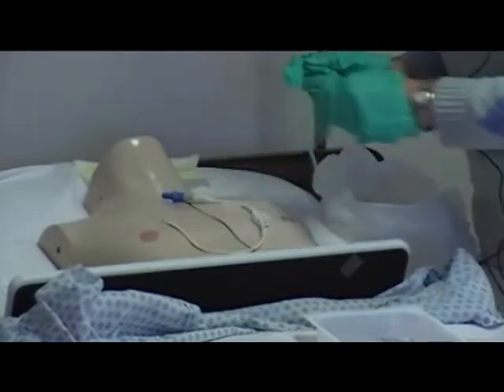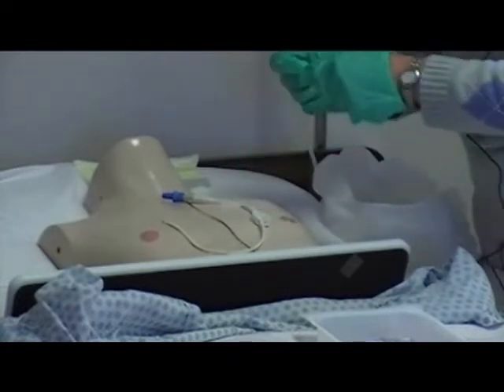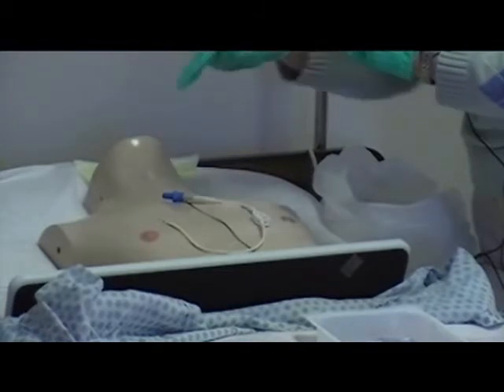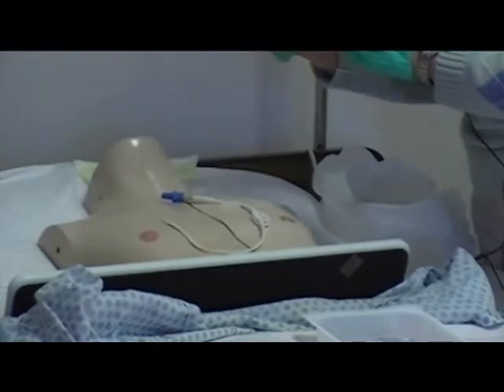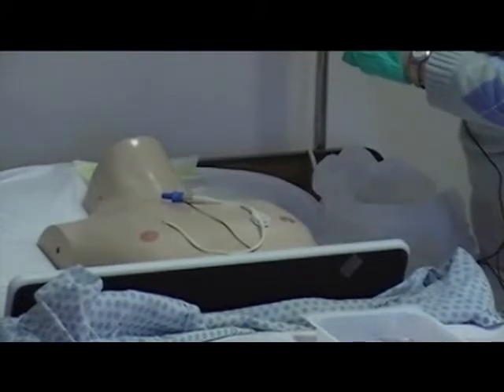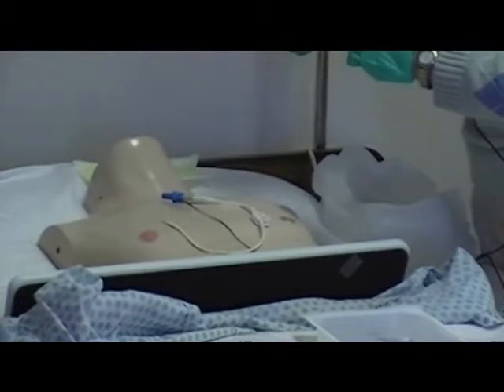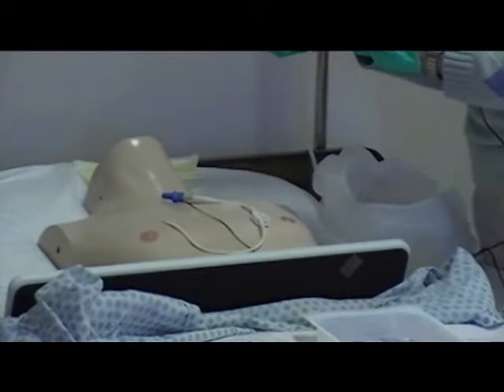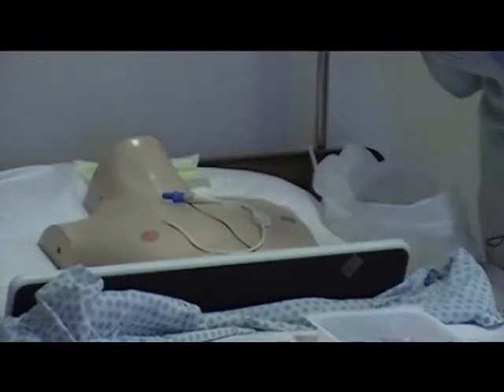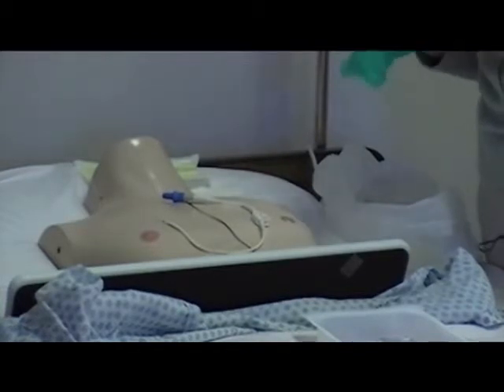So at this point, I am not going to touch anything underneath where that dressing was. I do not want my clean gloves to touch that catheter that was covered by the dressing. I don't want my hands to touch that insertion site. But I'm still assessing my insertion site, looking for anything else that I maybe did not see while the dressing was in place, and also noticing if there's any unusual odor. If there's an odor, there might be an infection present. So at this point, you're not going to want to put a dressing on until you have your nursing supervisor or the physician check that too.